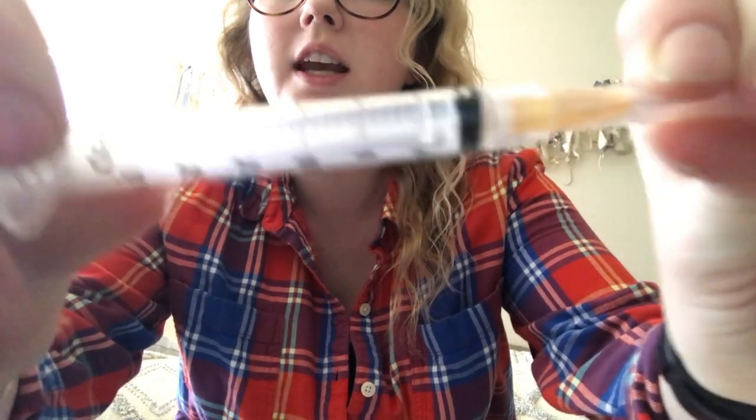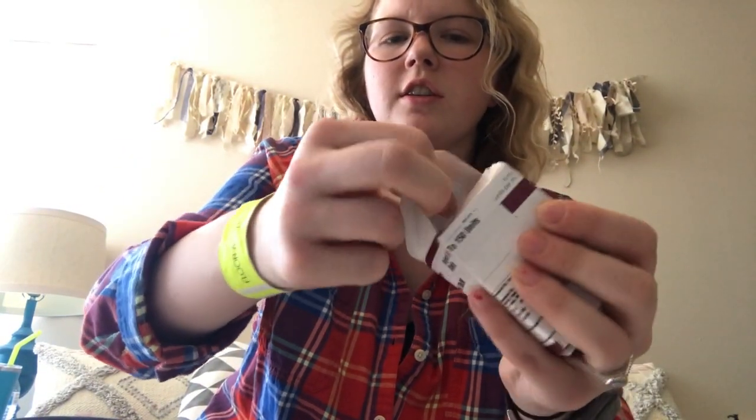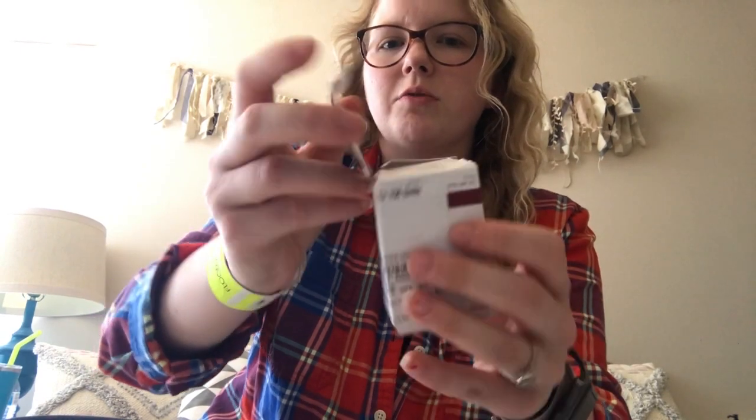This is a brand new box of insulin. It has a little perforation — you just tear the perforation — and then it has a little lid so it's reclosable later. It always comes with some instructions and some info about the insulin in case you need to know.